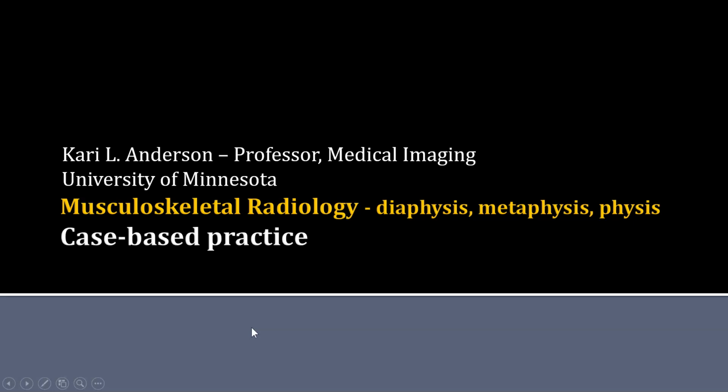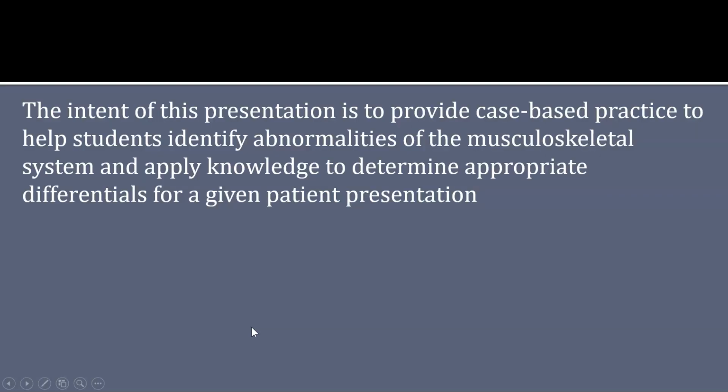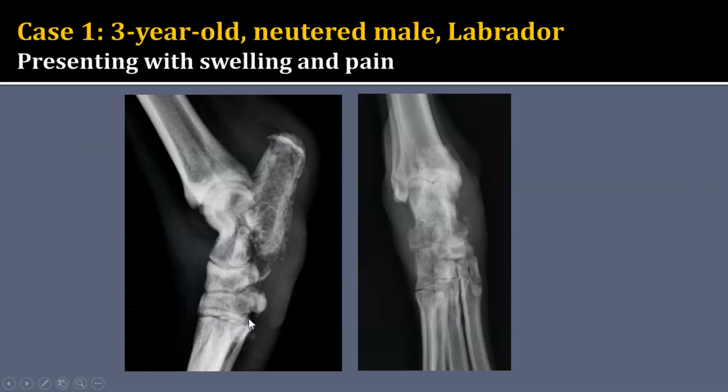Welcome to the last in a series of presentations on the topic of disorders predominantly affecting the diaphysis, metaphysis, and physis in veterinary patients. The intent of this presentation is to provide case-based practice to help you identify abnormalities of the musculoskeletal system and to be able to apply the knowledge that you have gained to determine appropriate differentials for a given patient presentation. So let's start with this first case.